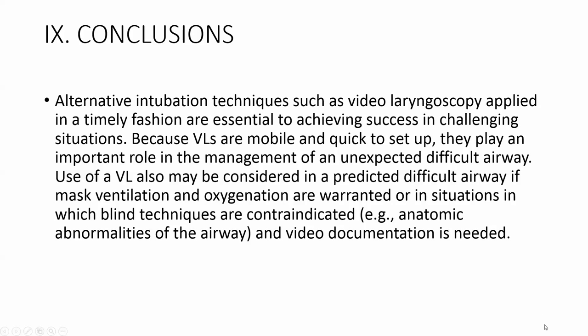Now, alternative intubation techniques such as video laryngoscopy are essential to achieving success in challenging situations. The video laryngoscopes like we have, the Glide Scope, are mobile and quick to set up and can be used in the management of an unexpected difficult airway.